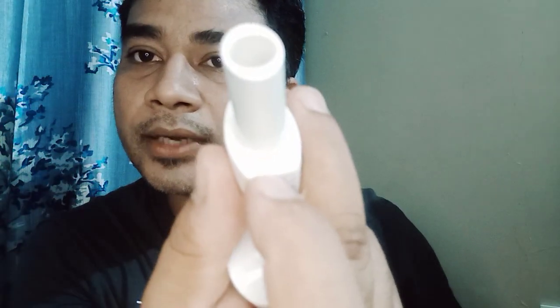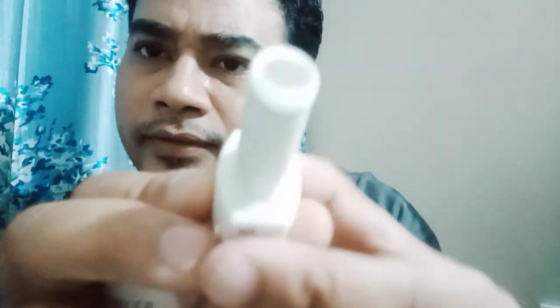See, the arrow mark is here. This side you will see it's a visible arrow. You will always find it here. It's an arrow mark that points, and it opens in this direction. This is pointing this side. It is not clear in the video, but you can very well see this in real life.